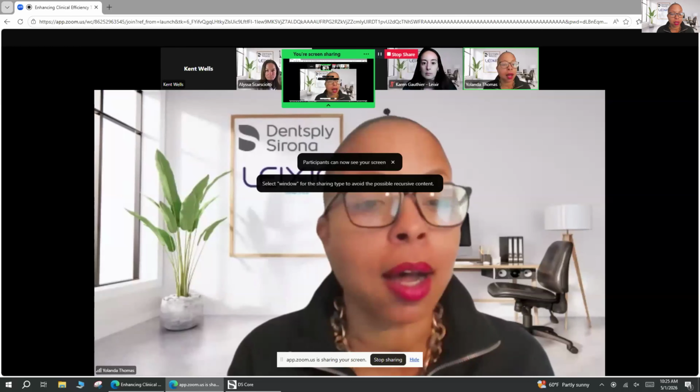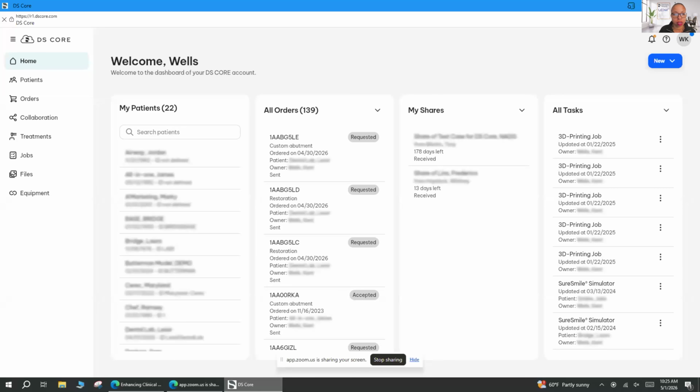I agree with Karen there because you want to stay HIPAA compliant. That's very, very important. And for everything to be there at your fingertips, and not missing any information so that we can process your cases rather quickly. I highly recommend this for sure.